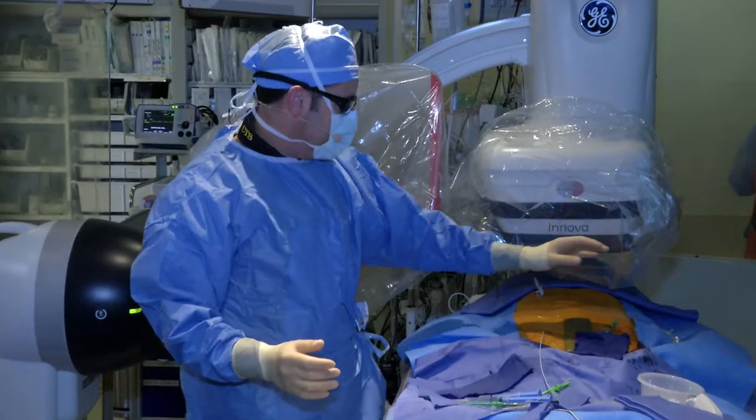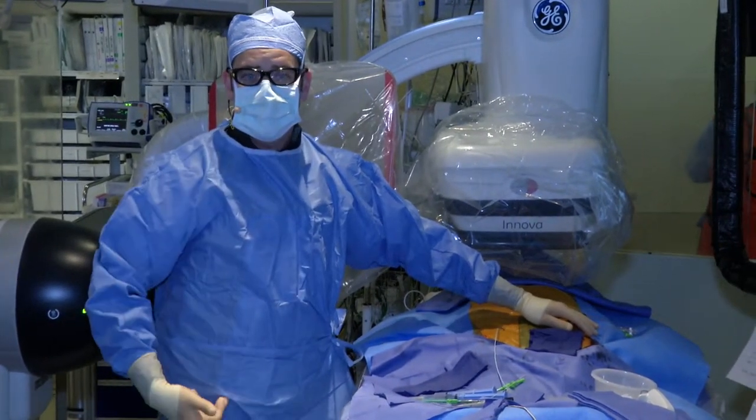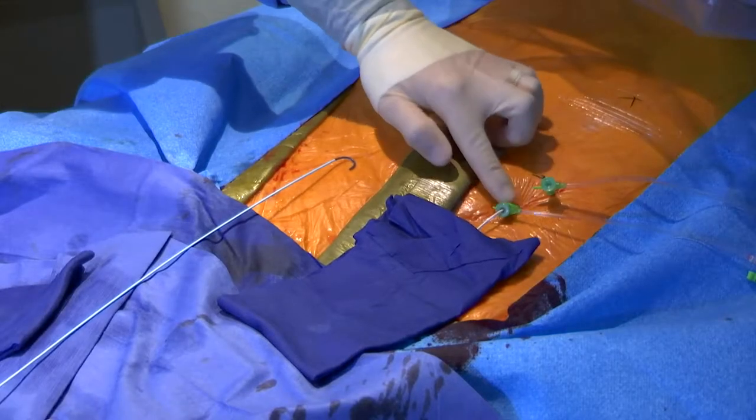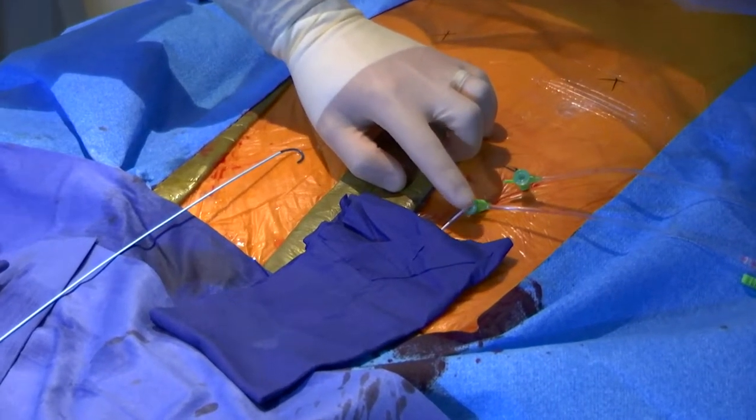So for this patient, Ray has already gotten access on the non-TAVR side, meaning the non-valve delivery side. So there's one little small 6 French sheath in the artery and one 6 French sheath in the vein. And this little white thing here is the temporary pacemaker wire.